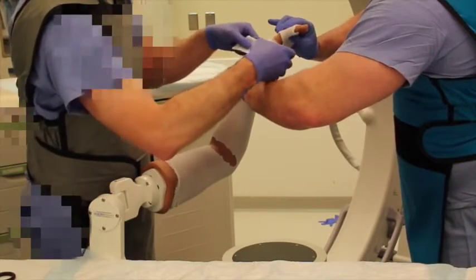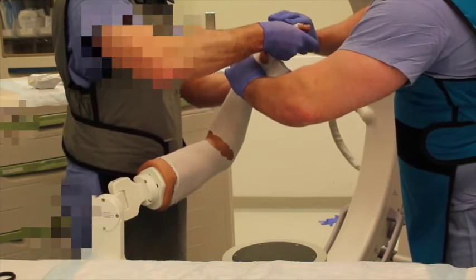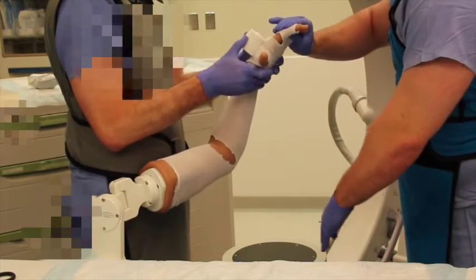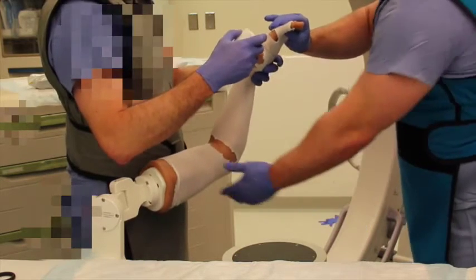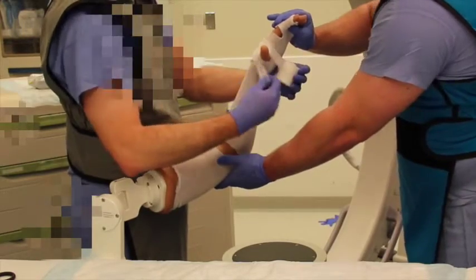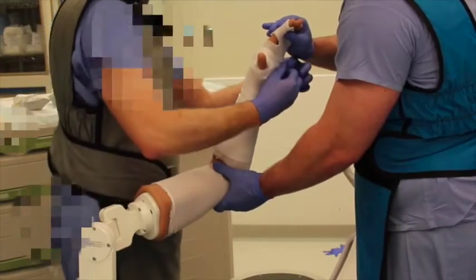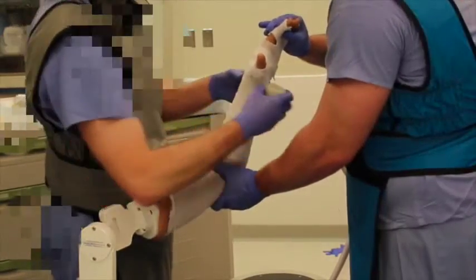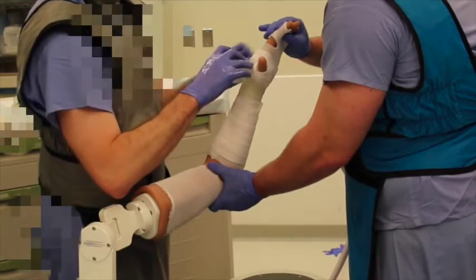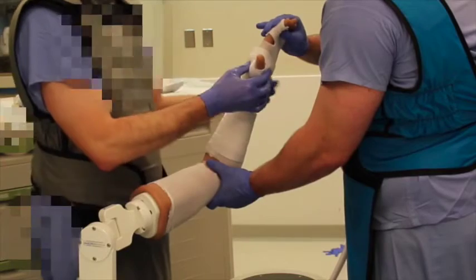With an assistant stabilizing the arm, a long arm cast can be applied by first applying a web roll. Care is taken to hold the arm and fracture in the reduced position during the casting procedure. The edges of the cast are well padded. An initial short arm cast is applied — this can be either fiberglass or plaster of Paris.